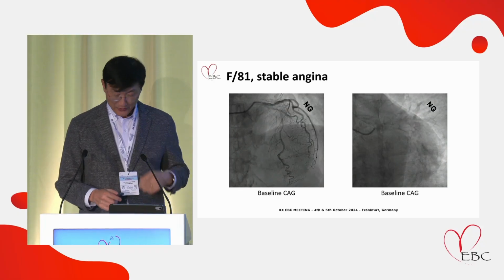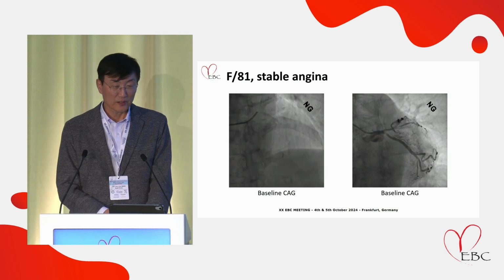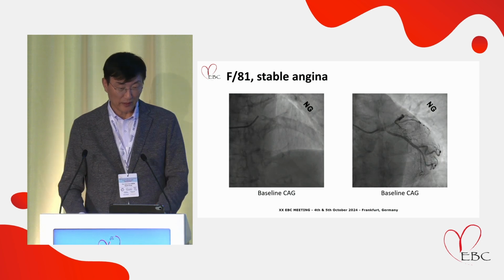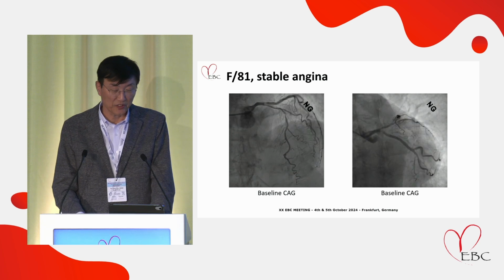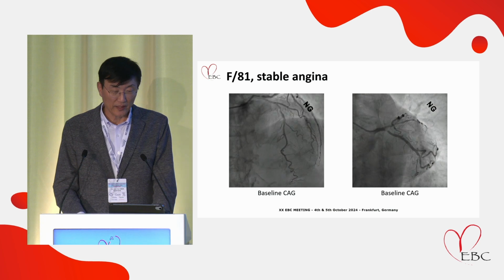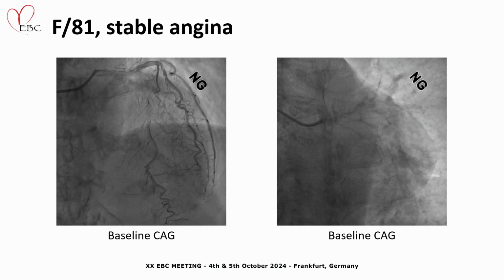I really appreciate being invited to this meeting, and I come back after 3 years of absence. Nice to be back. Let me start with a case of calcified lesion and stable angina. The 81-year-old female patient presented with a left main bifurcation with a diffuse LAD lesion. You can see a severe calcification both in the LAD and circumflex. This is a Medina 011 case with a severe calcification.